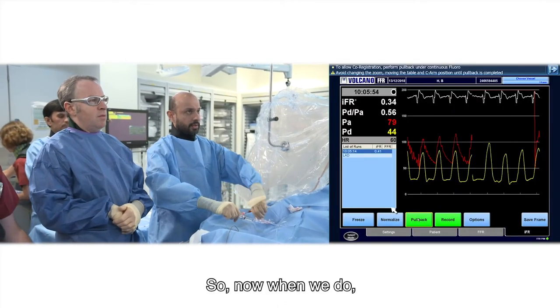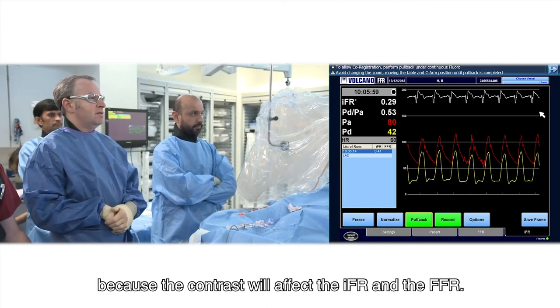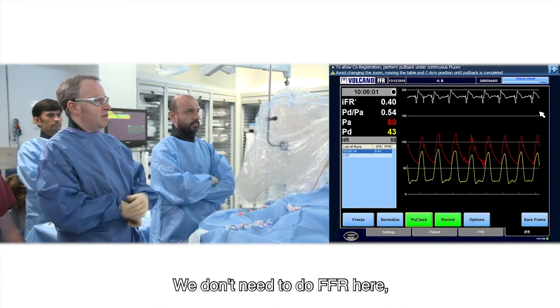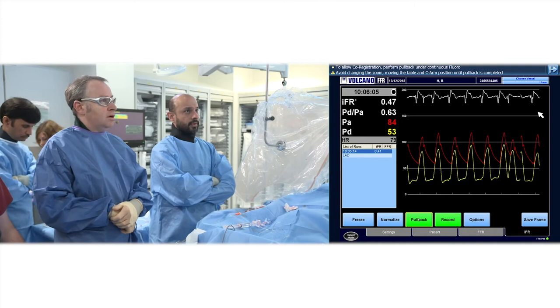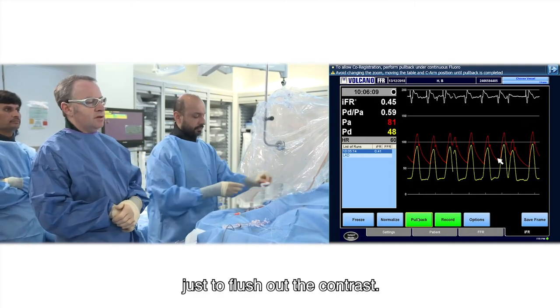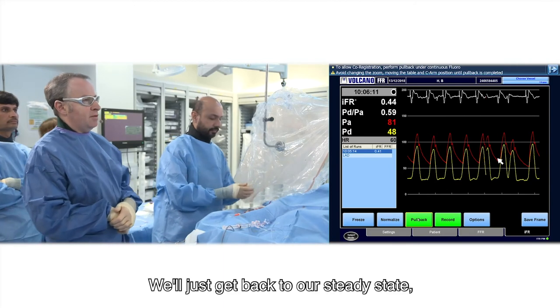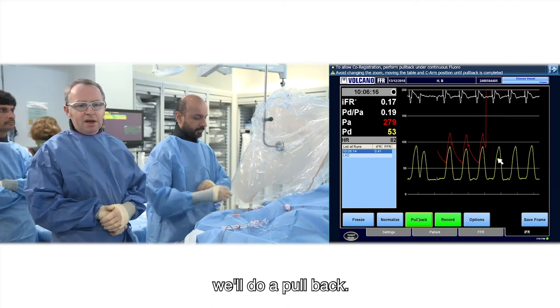So now when we do, we just let that flush out the system, because the contrast will affect the IFR and the FFR. We don't need to do FFR here because the IFR is clearly highly significant. Can we just have a flush to flush out the contrast? We'll just get back to our steady state, and then when you're ready in a couple of minutes, we'll do a pullback.